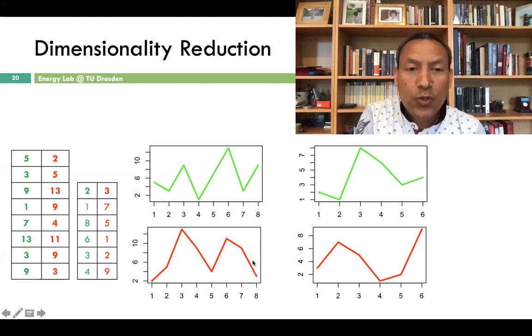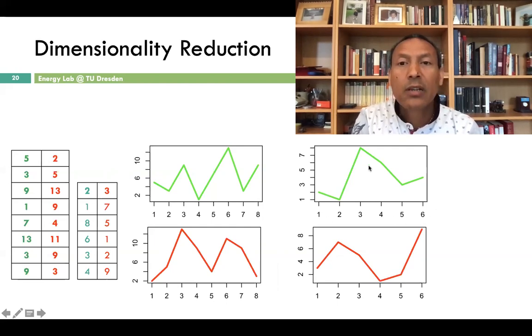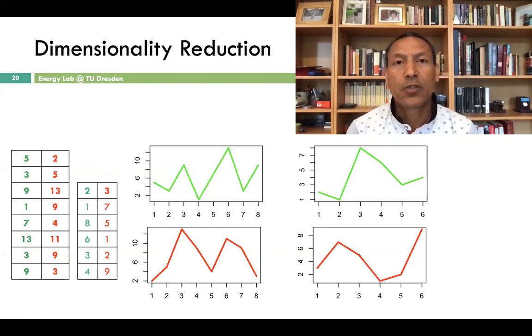And in fact, we can also see how much each channel, we had 8 channels, contributes to describing the first feature and the second feature, and how much each sample contributes to describing the first feature and the second feature. So by closely examining these features, it is possible to extract useful insight from raw data.